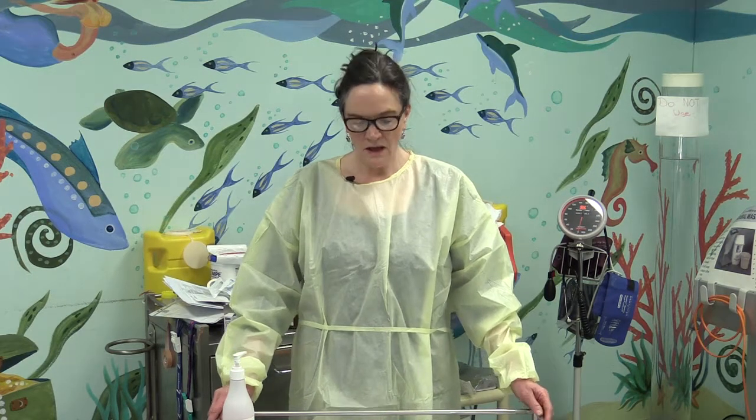Once we've established that the patient has peritonitis and we've collected the sample of dialysis fluid, we need to disconnect the patient from the set using an aseptic technique and set up a new set of dialysis fluid and peritoneal dialysis set completely from scratch, just as we did at the beginning of the video. Once that's set up, we're then going to add the medications that we need to treat peritonitis.